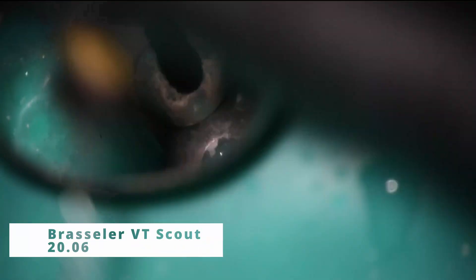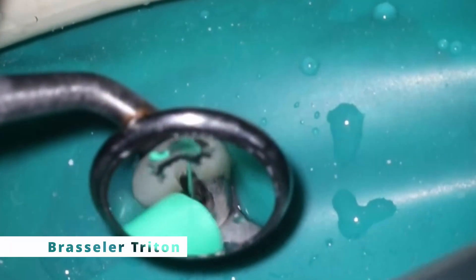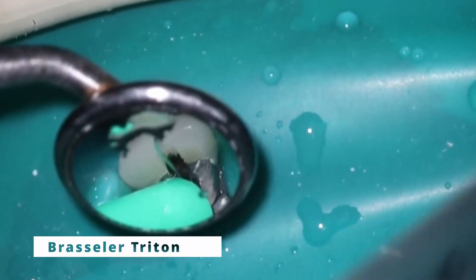Hopefully this is helpful. We'll go through the process of the tooth — we got a nice little stick there. The 20/06 is able to drop down, and once you find these canals for anteriors, if they are a little bit calcified, they open up extremely quickly. Usually when calcification occurs it's in the coronal aspect of the tooth, and the apical portion still stays pretty wide open.